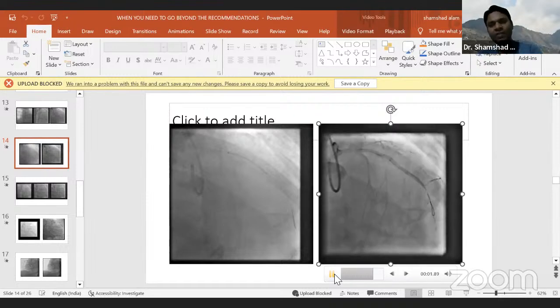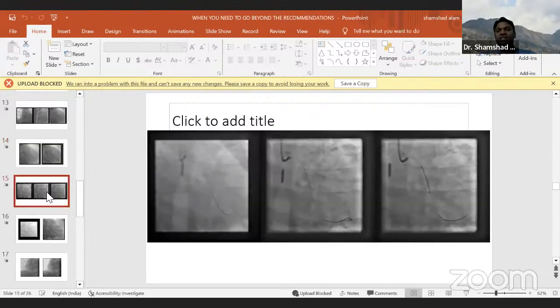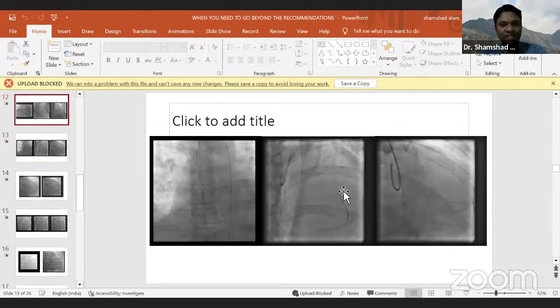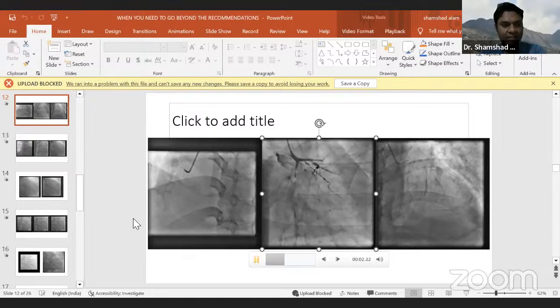A distal lesion was there in LAD, but we were not that keen on disturbing that lesion at this moment, as the patient was in cardiogenic shock and requiring multiple inotrope support. Then we planned that we will tackle that circumflex lesion also, because the LAD area was already infarcted and circumflex was giving a very large area of blood supply. I can show you the circumflex, because due to that technical glitch, you could not have seen it. This was the circumflex.